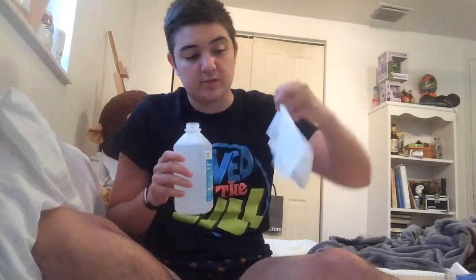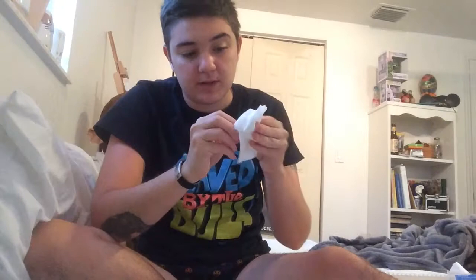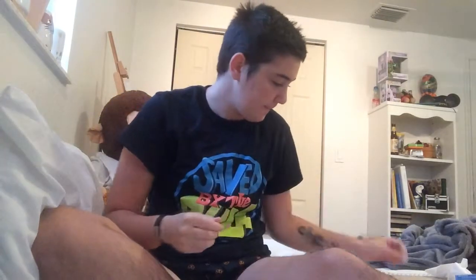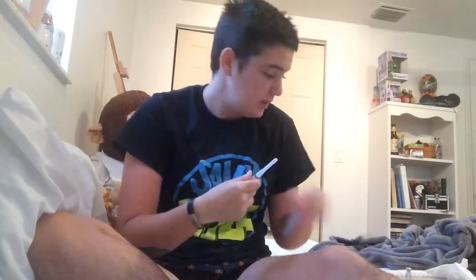The next thing I'm going to put rubbing alcohol on is the tip of my bottle. Because I'm using this for more than one prescription, as most people do, there is a time where it's exposed to the elements and I want to make sure that it's nice and clean so that way I'm not getting any extra bacteria in me. All right, so I have my area picked out, I have my testosterone bottle ready. So now what I need to do is have my bandaid prepped — just have it open that way it's ready for once I'm ready to use it.